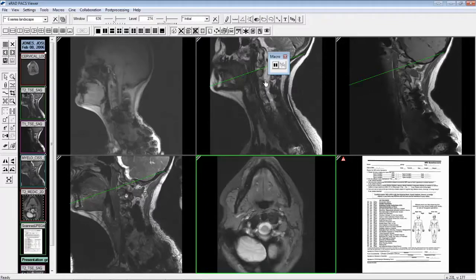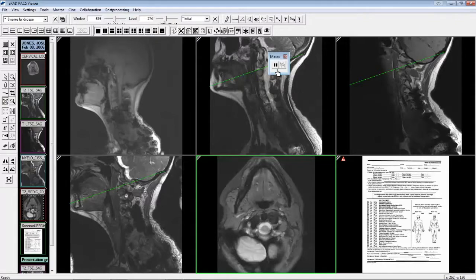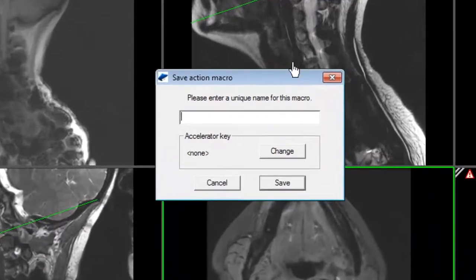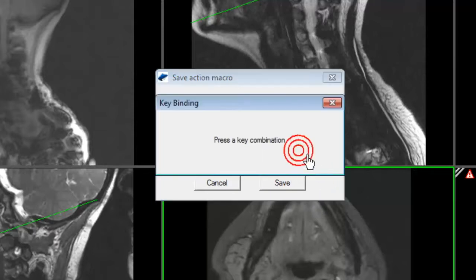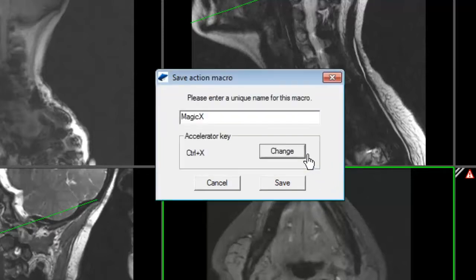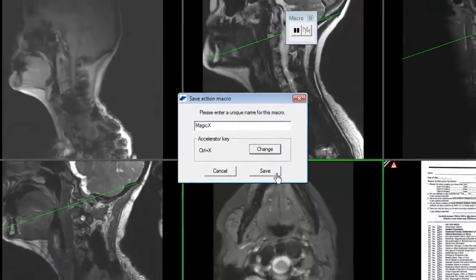Select the desired viewer function. I'm going to use the magic X. Click the stop recording button on the macro toolbar or from the top menu. Assign the macro a name. Click the change button to define the shortcut input sequence. Click save when finished.